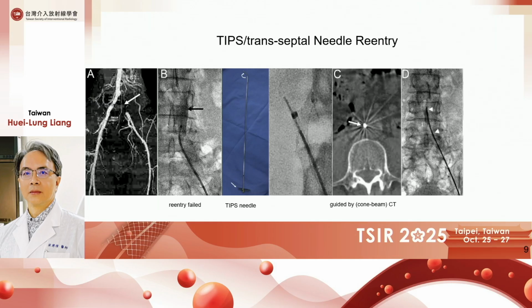In this patient, although the occluded region is in the left common iliac artery, the needle tip was on the right side aortic wall at around 9 to 10 o'clock direction.